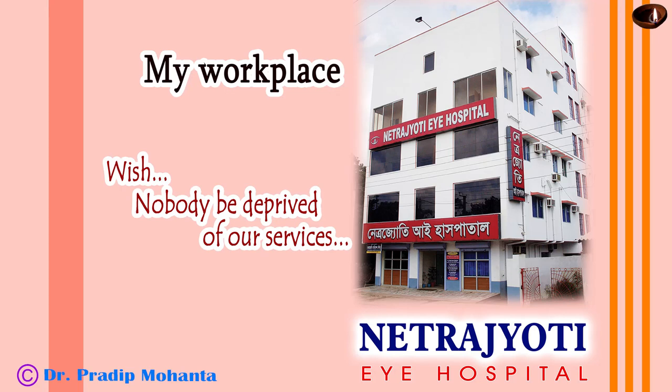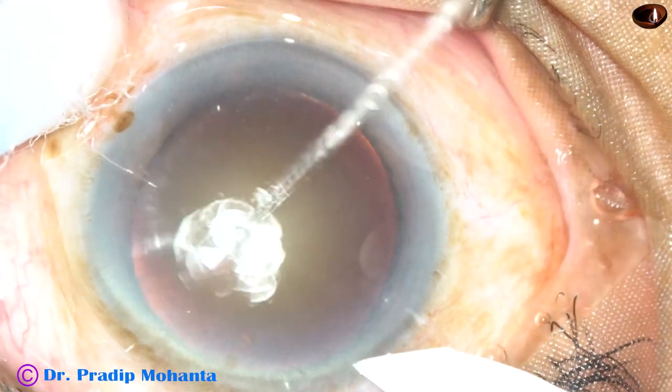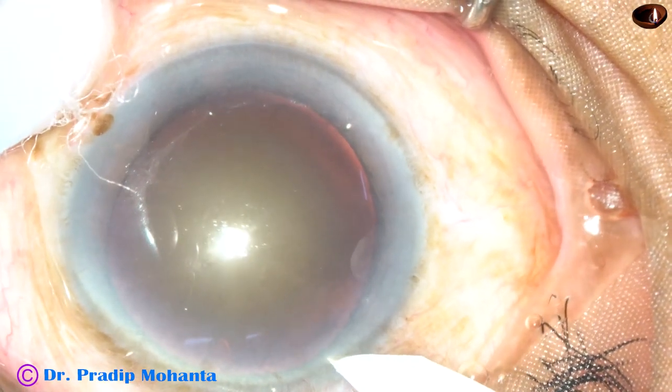Friends, welcome to my workplace at Rana Ghat, West Bengal, India. This is a cataract with grade 4 nuclear sclerosis. Let us observe the surgical steps.